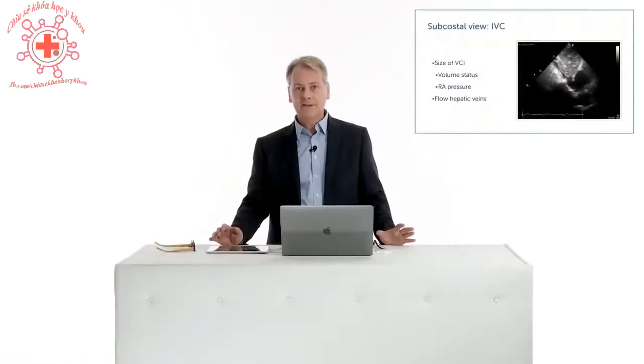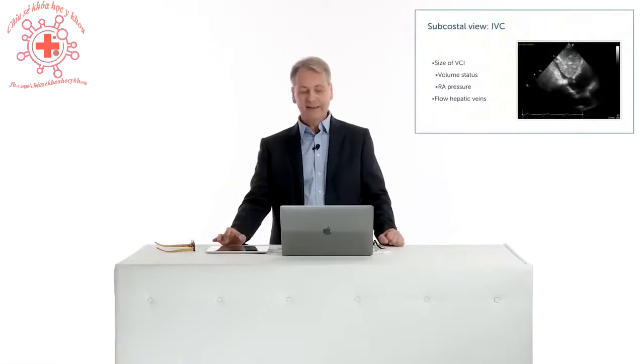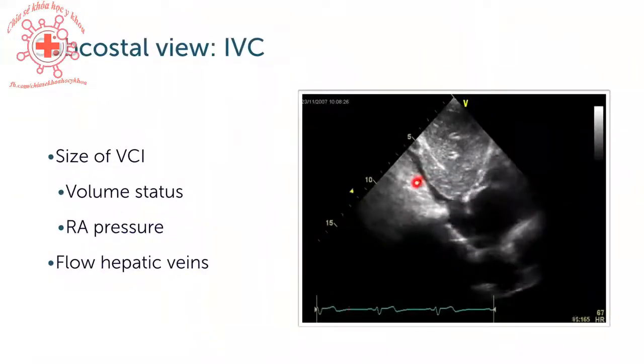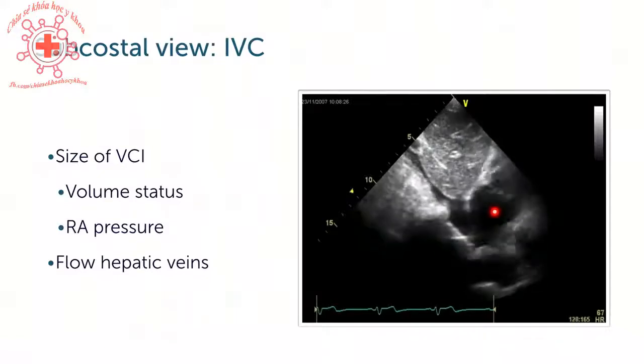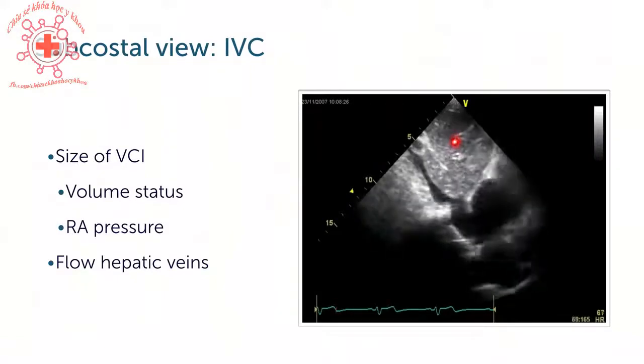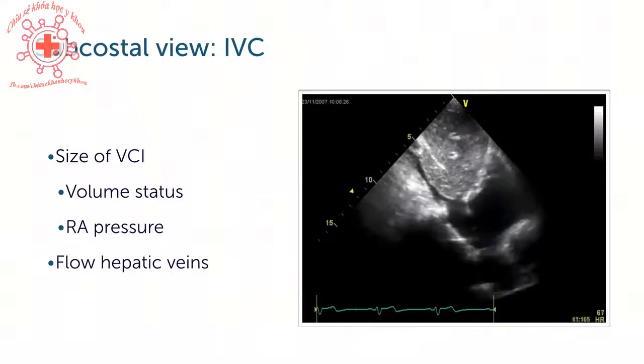What are the clinical indications for this view? Well, basically to assess the size of the IVC, which corresponds to right atrial pressure, and also to look at flow in the hepatic veins.